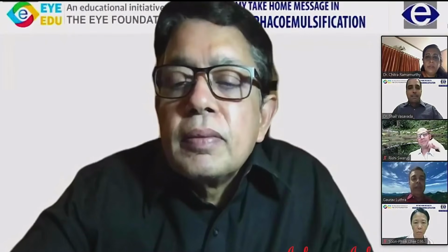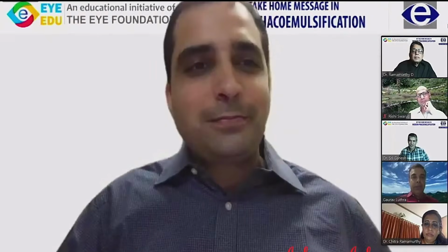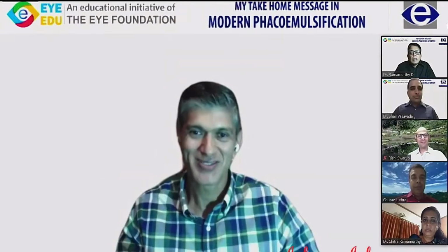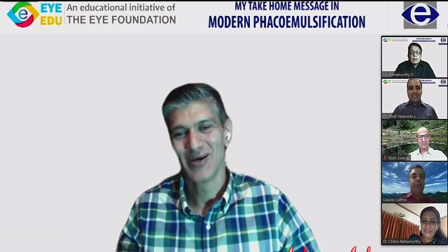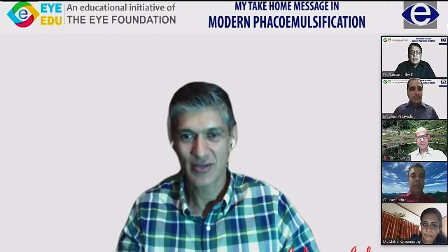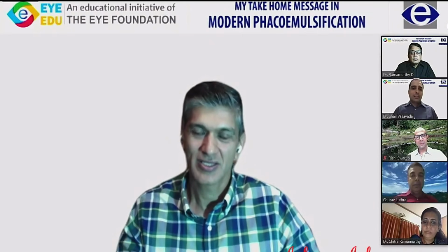Okay, Shail, excellent presentation. Just a few points, because now we are teaching our juniors, and after Abhay's wonderful lecture, a lot of our juniors also have started. The main difficulty they find is that when they're using the trocar, they're very hesitant when penetrating the sclera.